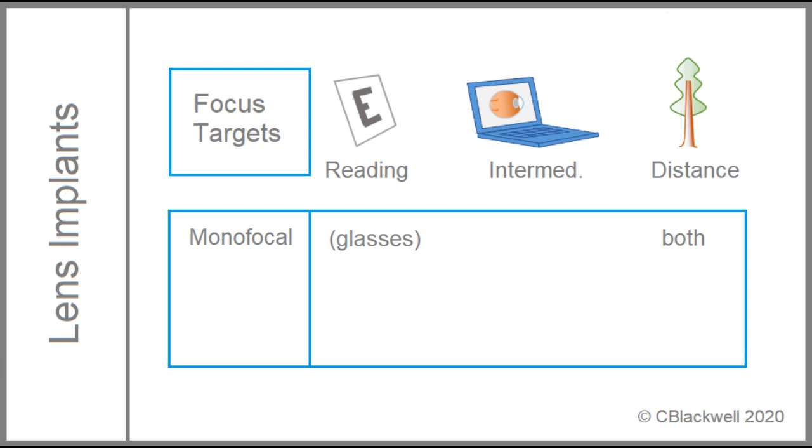Years ago in cataract surgery, we only had single power lenses. Usually, we put distance lenses in both eyes, meaning glasses were needed to see up close. One notable exception was people who were nearsighted before cataract surgery. They often preferred to remain nearsighted afterwards so they could still read without glasses. They were used to wearing glasses for driving and distance. On the other hand, the hyperope was happy with distance correction because now he or she could see something without glasses. These options worked well, but the drive for independence from glasses led to new strategies.